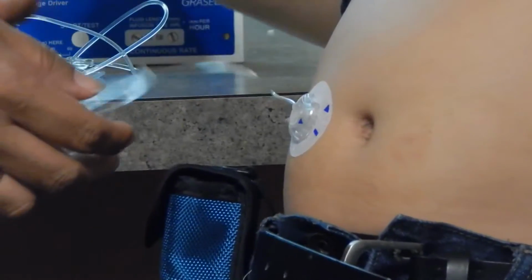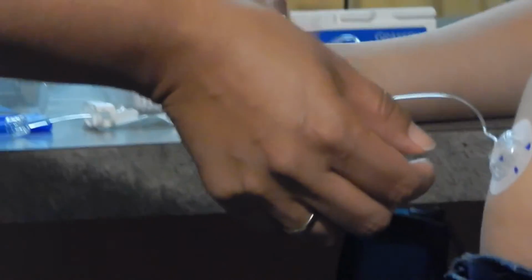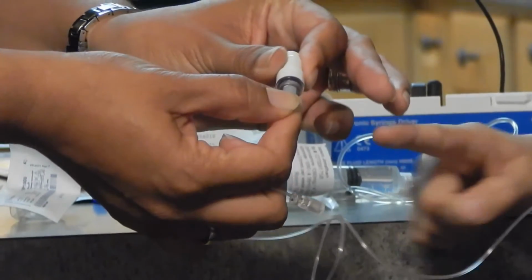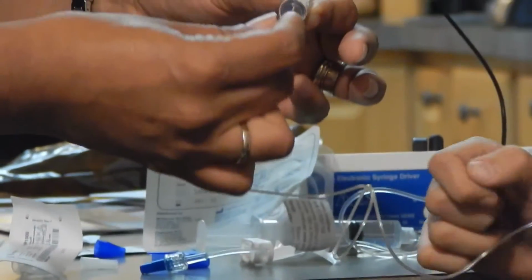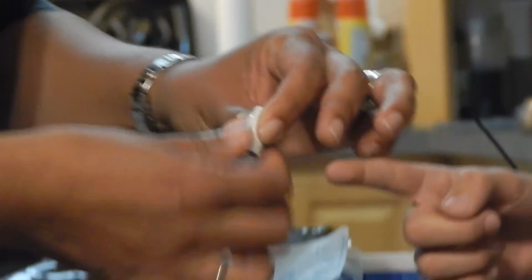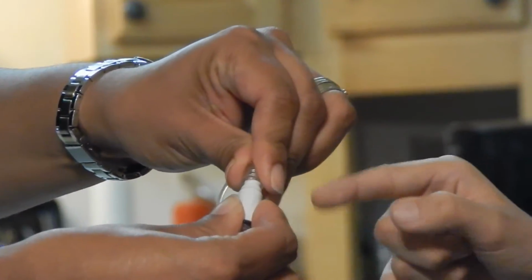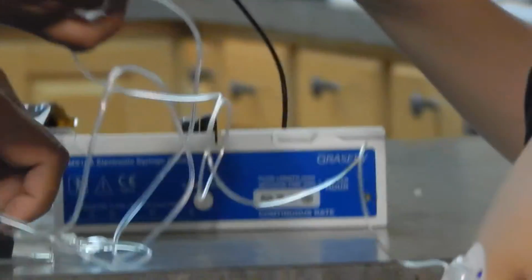So we take off that white thing, and now we're going to connect everything together like a puzzle piece. We got the connector, that white thing you saw earlier that connects to the syringe. You grab that and connect it to the line. Next, we get the syringe and take off the blue cap on it, and then we put the syringe into the blue side of the connector. And now it's all connected.